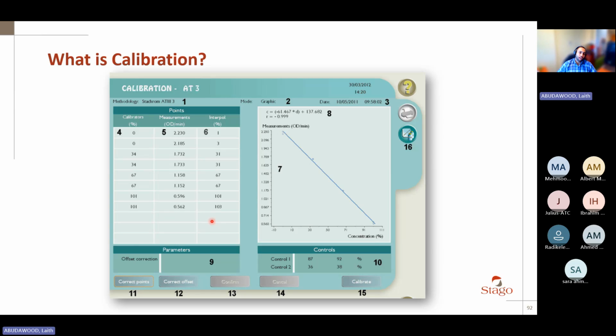Now, why do I have to run multiple dilutions? Because if I run one concentration and it tells me, oh, optical density is 1.1, 1.2, 1.3, okay, fine. How about lower concentrations? How about the lowest concentration? I don't know.